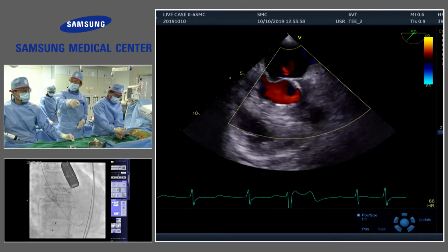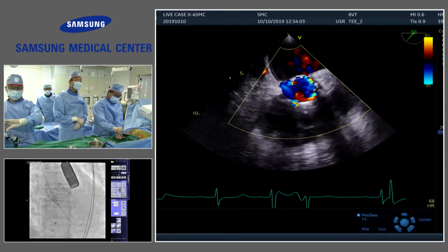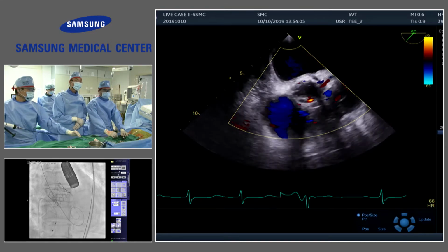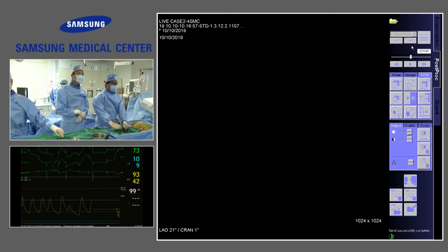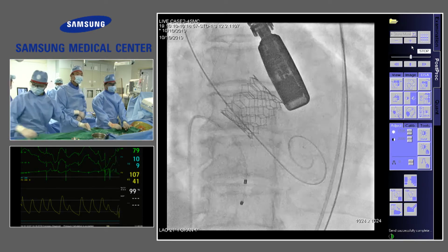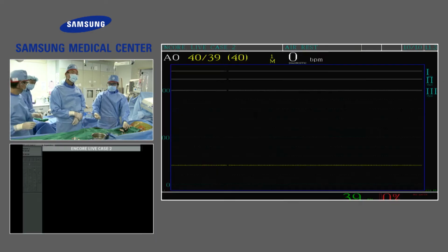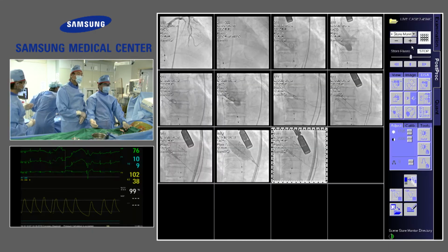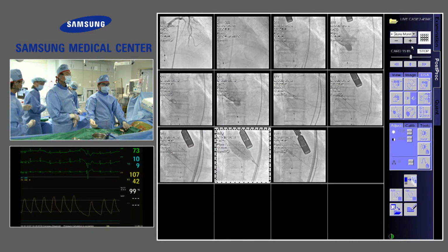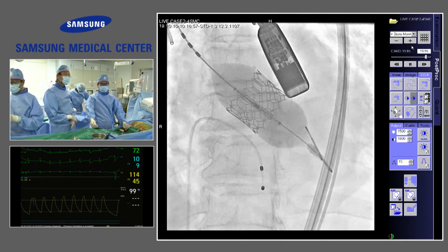Dr. Gwon, we are happy with the pressure. We are very happy, but I never ever take a decision for post dilatation before I take the wire from the ventricle, because the overestimation of AR and even of the paravalvular leak by the wire is sometimes really robust. So I'm taking the wire out, giving injection, looking at the echo, and then I decide.